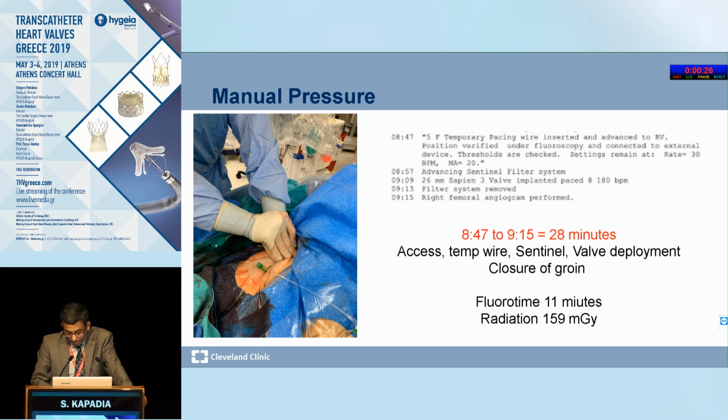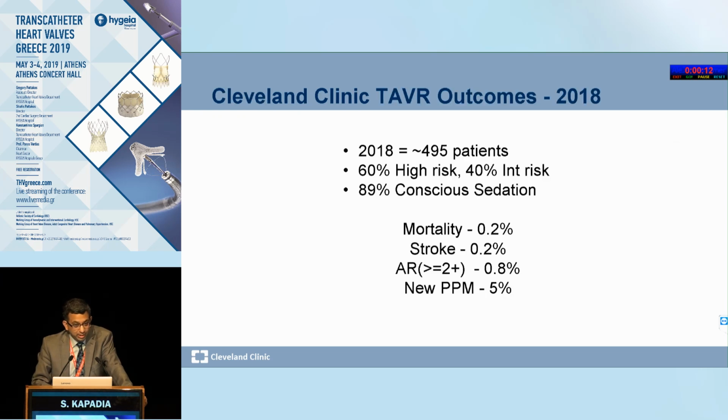So we are now, this is in my way minimalistic approach, even though, and look at this, 11 minutes of fluoro time. We looked at the patient for 11 minutes because the only way we look is with X-ray. So we looked at 11 minutes to his heart.